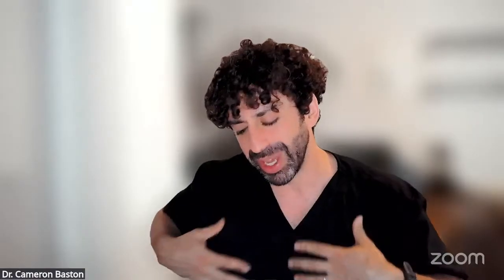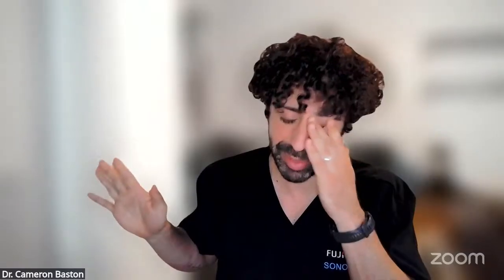That's my issue. Those are some of the pitfalls from parenchymal ultrasound. I talked a little bit about the pitfalls with diaphragmatic ultrasound, with the idea being that if you're looking when somebody's on the vent, you may not see any thickening of the diaphragm. And with effusions, the challenges I've seen people mistake the gastric space for pleural effusion when it's full of liquid.